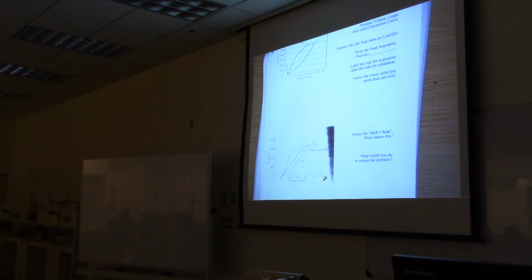it means that there's a lot of pressure building up when you're squeezing the last amount of air into the lungs. What's a better word than the last amount of air? The remaining tidal volume into the lungs.